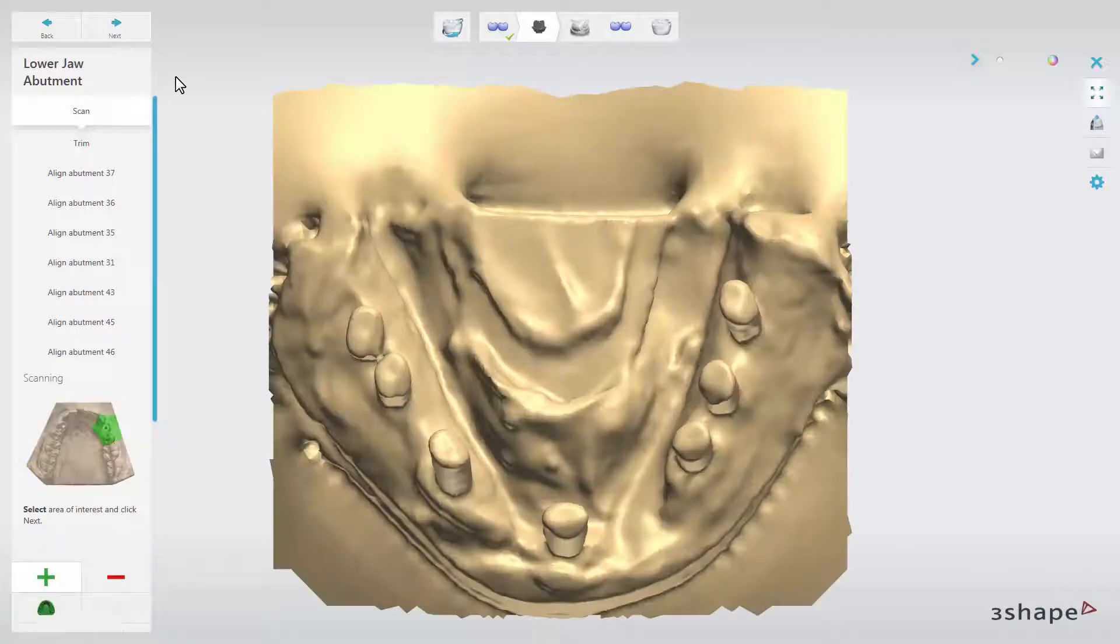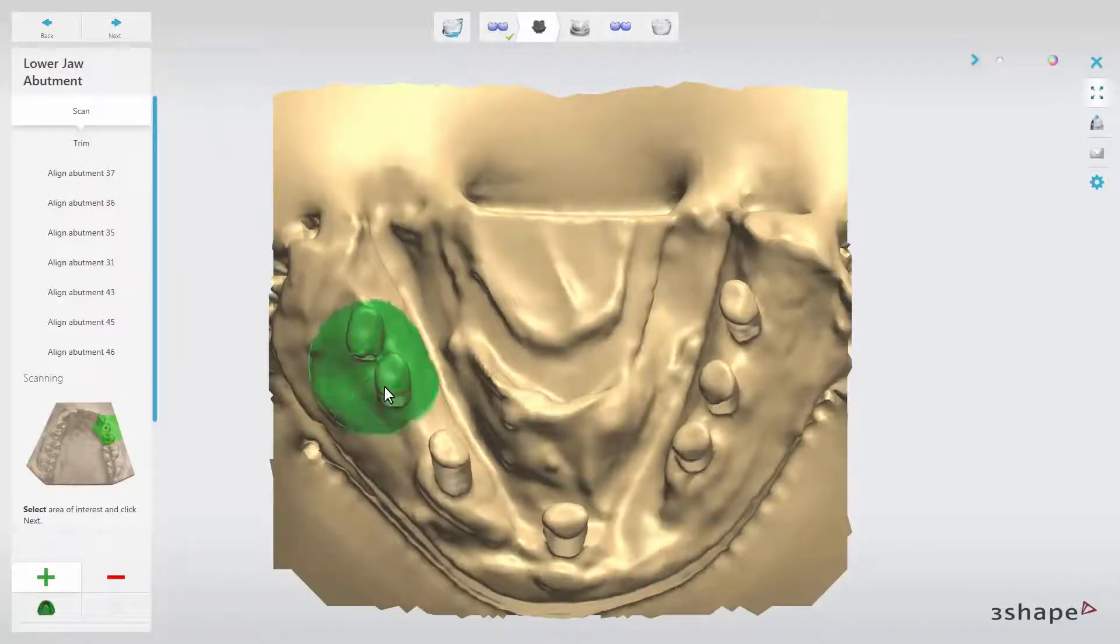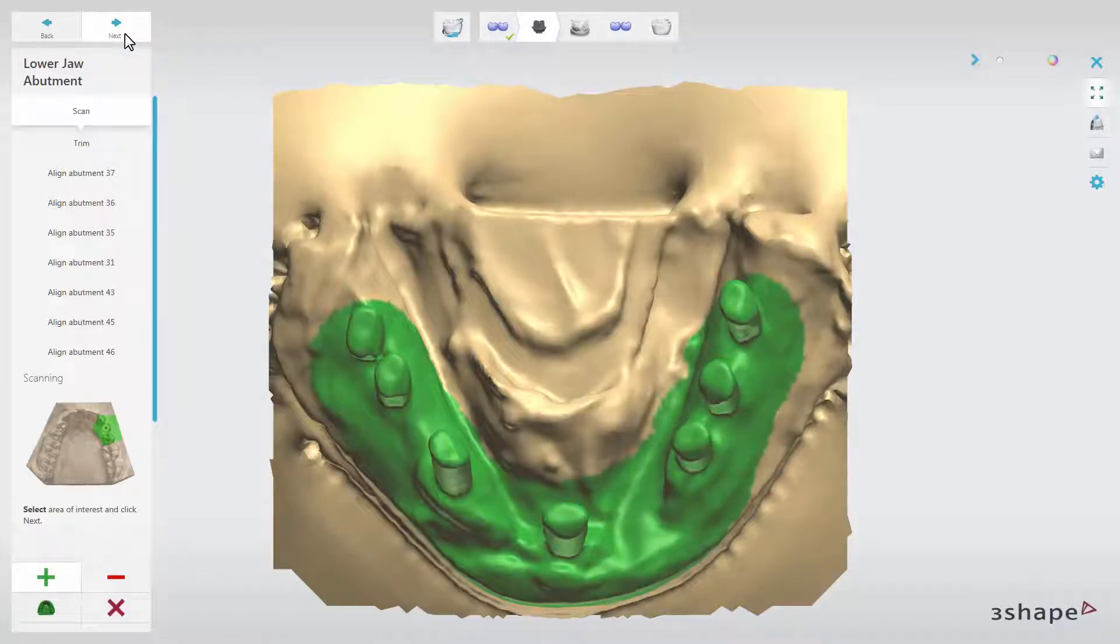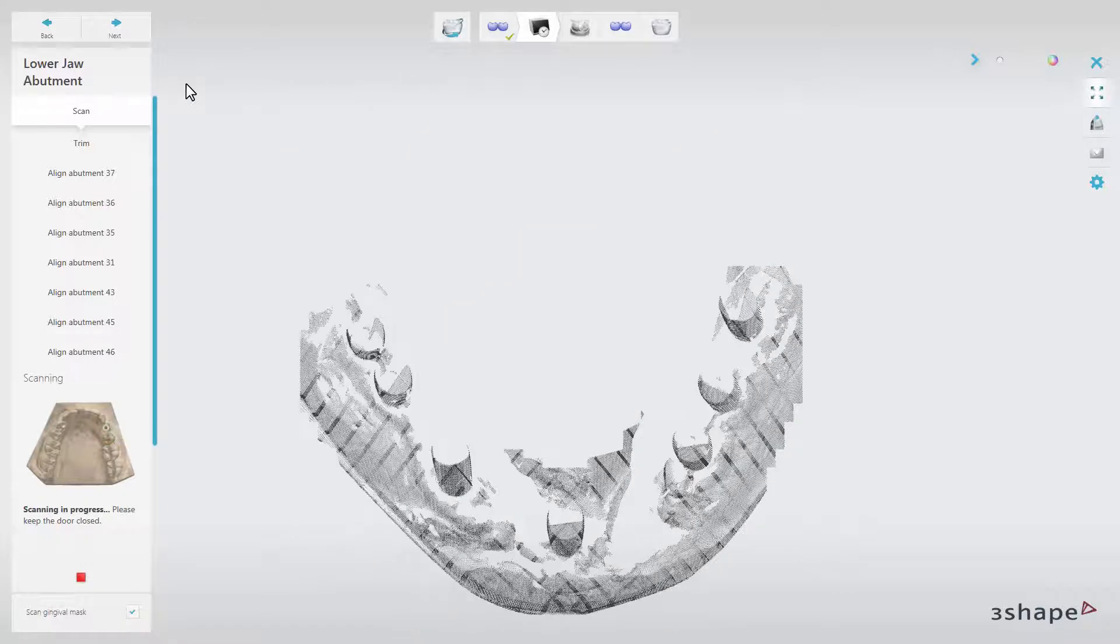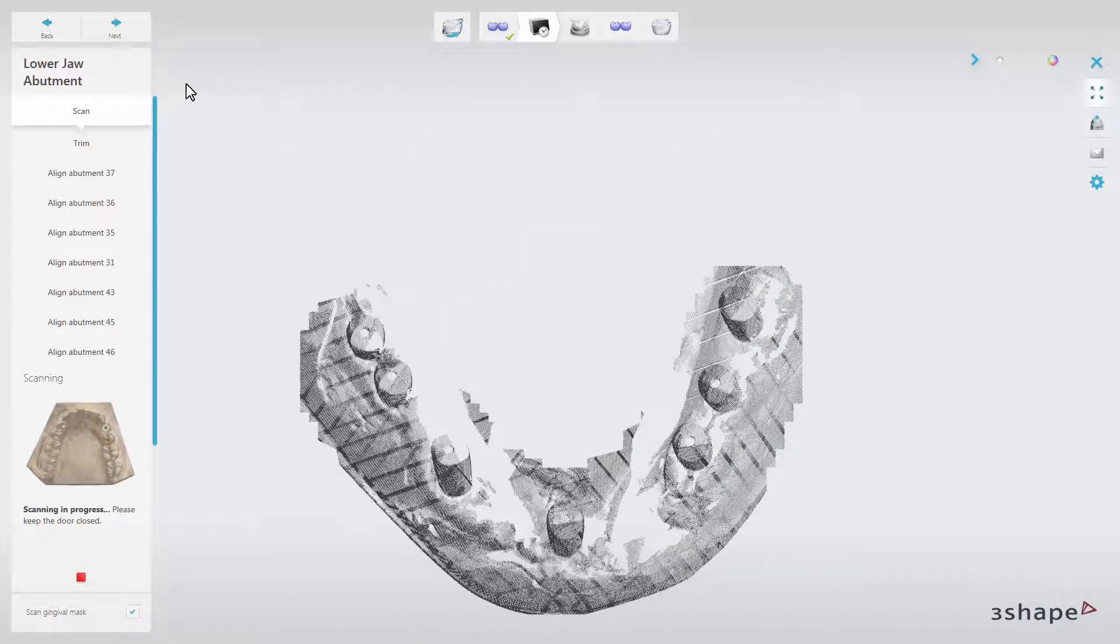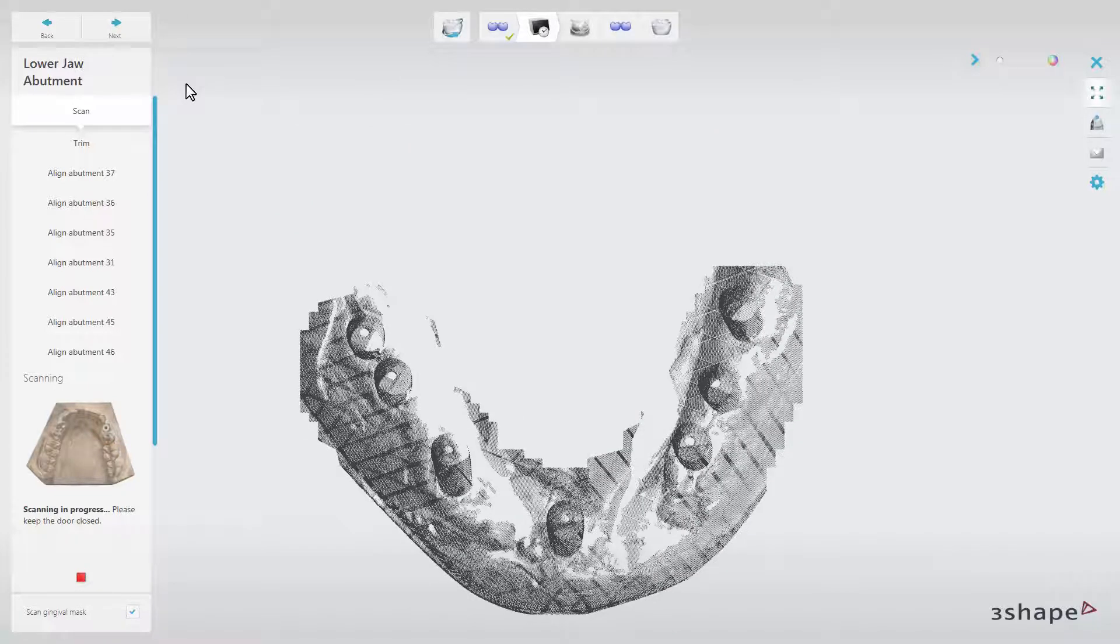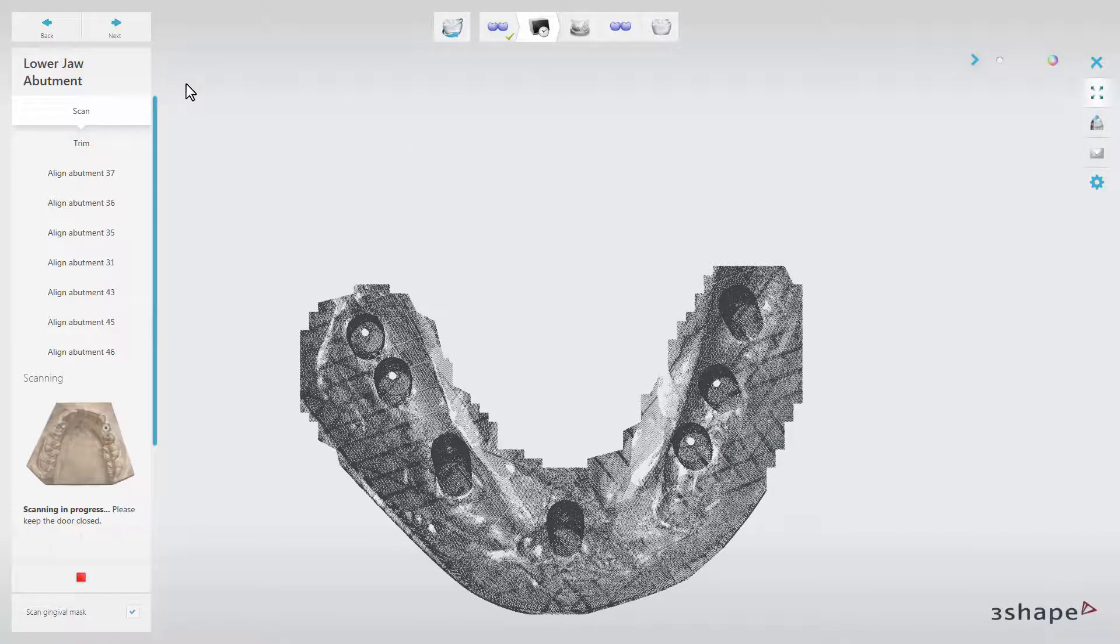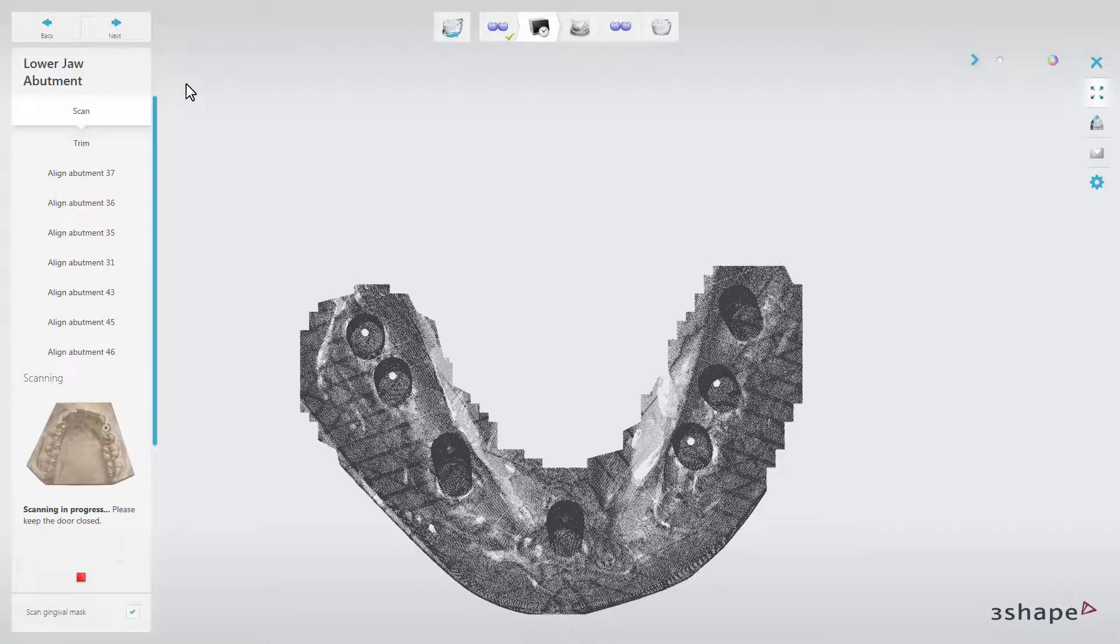However, as you can see in our example, we have enough scan abutments, so we will scan all of them at once. Again, select the area of interest and click Next. The software will start scanning. Wait until the process is completed.